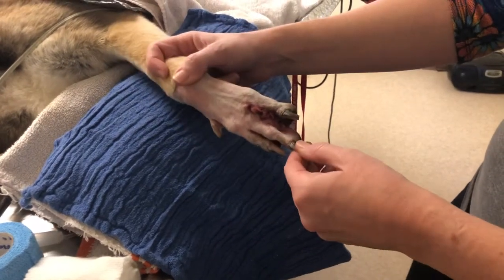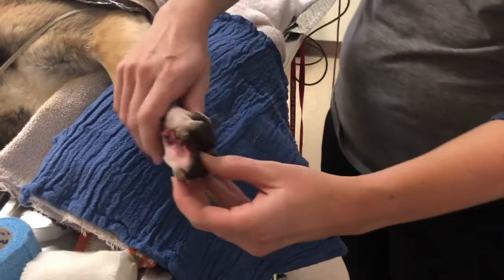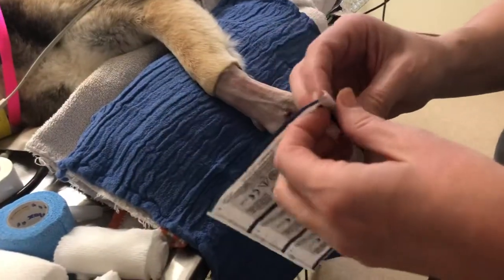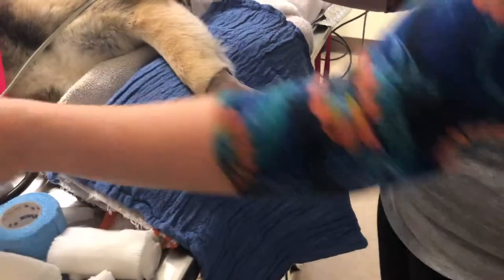Here's Bodhi's bandage. He has sutures on the top and also a couple of sutures on the bottom in the webbing, so we're going to want to put a telfa across over the suture areas.